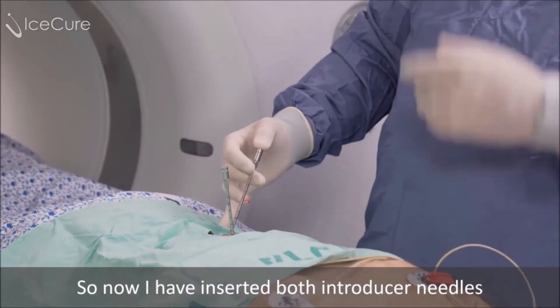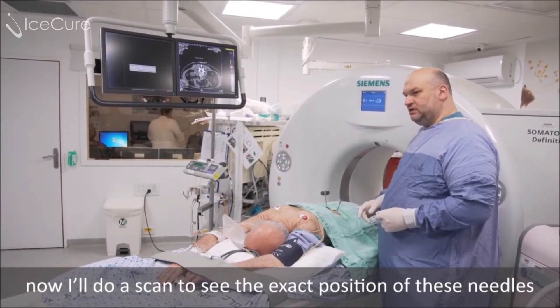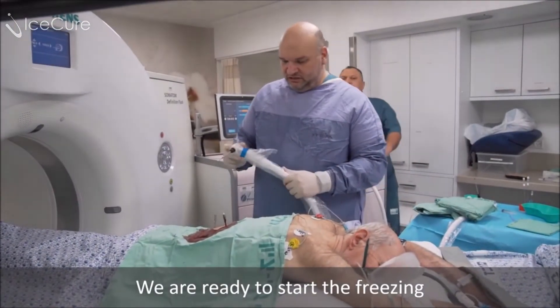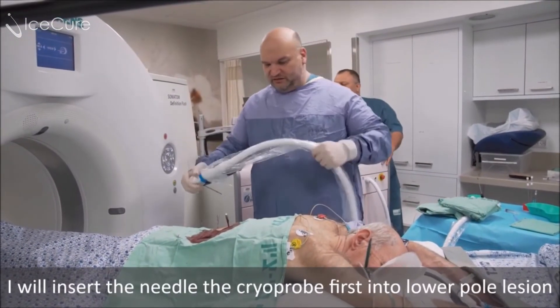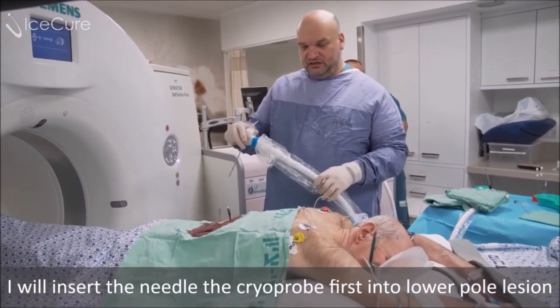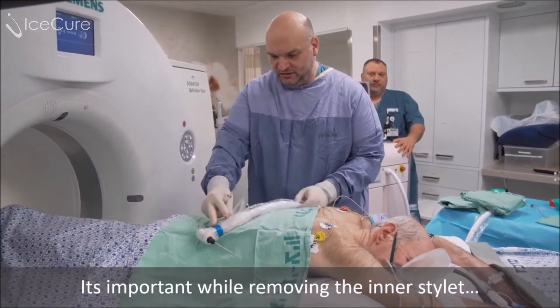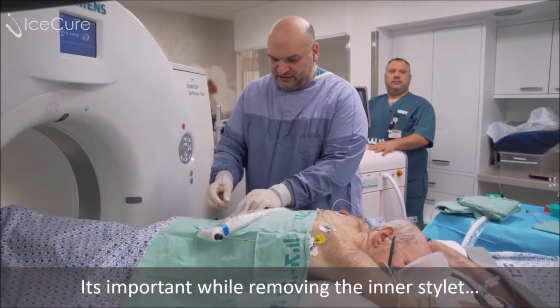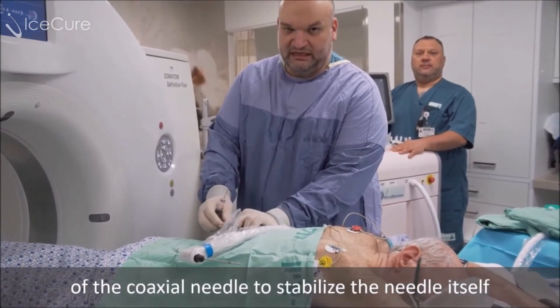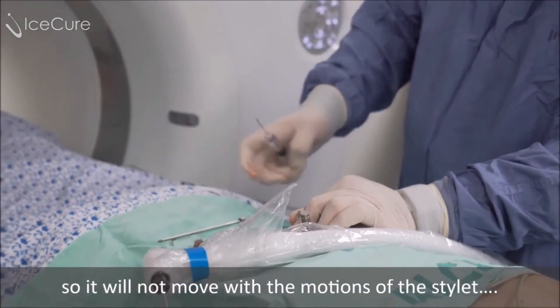I have now inserted both introducer needles, and we will do a scan to see the exact position of these needles. We are ready to start the freezing. I will insert the cryoprobe first into the lower pole lesion. It's important while removing the inner stylet of the coaxial needle to stabilize the needle itself so it will not move with the motions of the stylet.